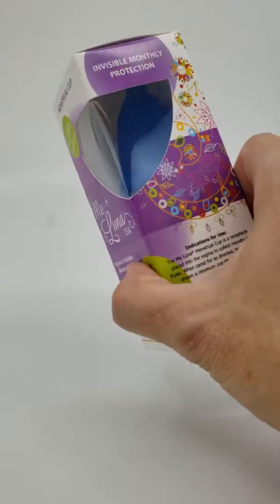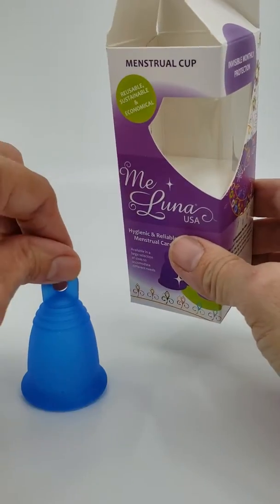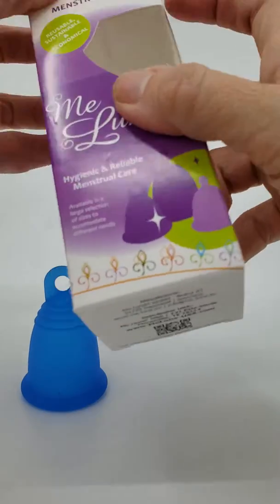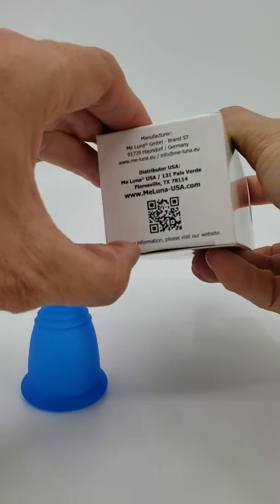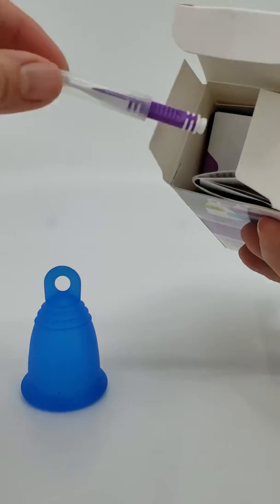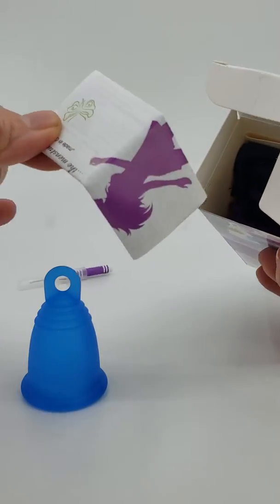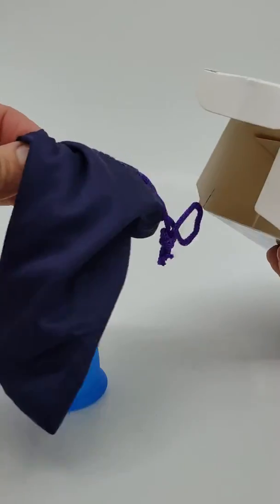Your cup will be on top so you can remove it from the top. Here we go. Your other accessories will come from the bottom. You can simply open that. This is your cleaning brush, your instructions, and your storage pouch.